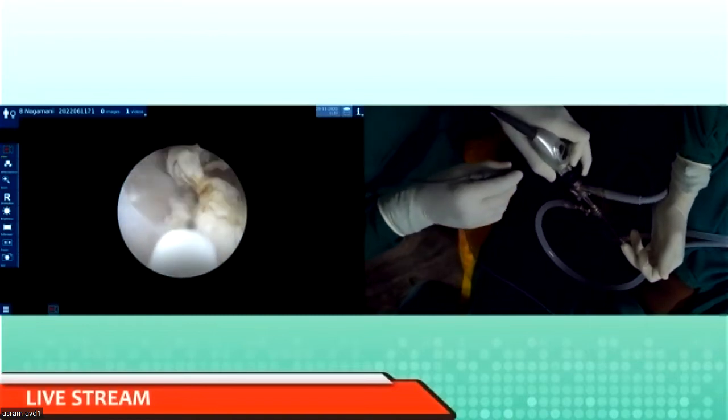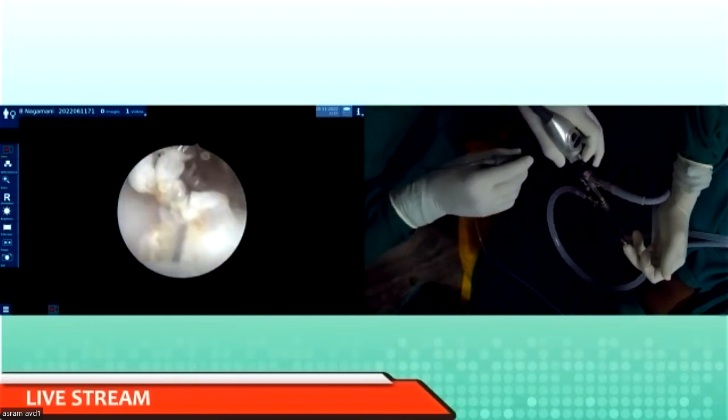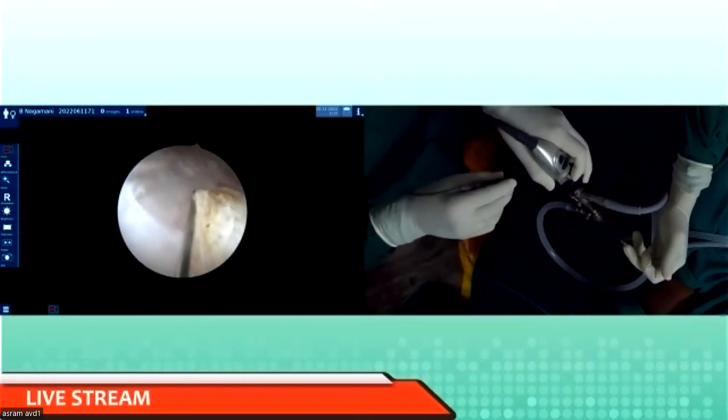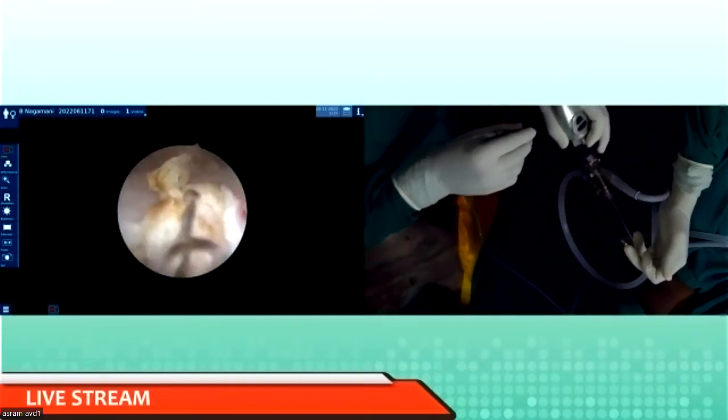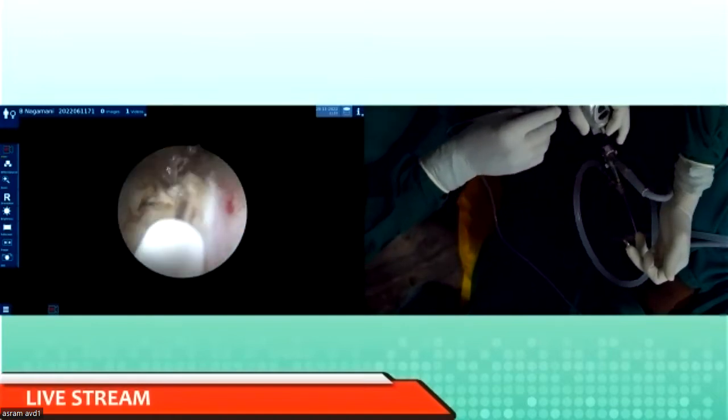Okay, now I am using bipolar. And you know the price of this needle? Awesome. 38. Don't tell me it is single use. I broke 4 of these. Very, very gentle. Very, very delicate needle this is.